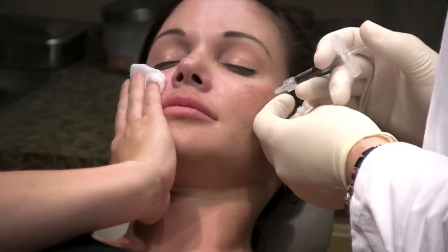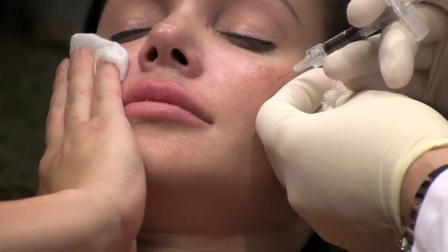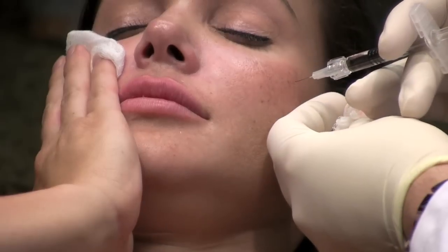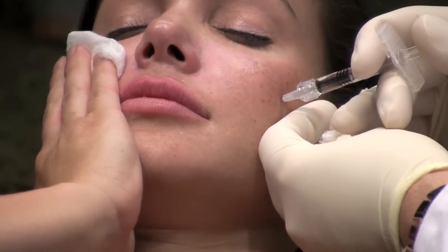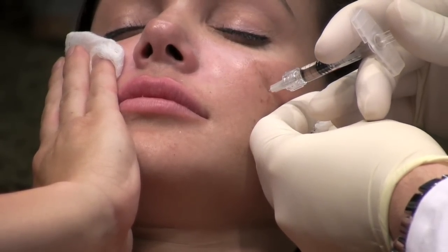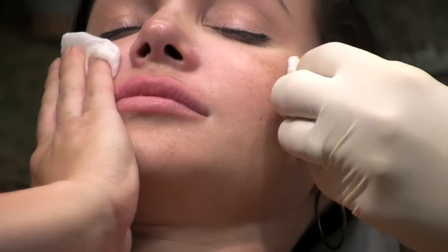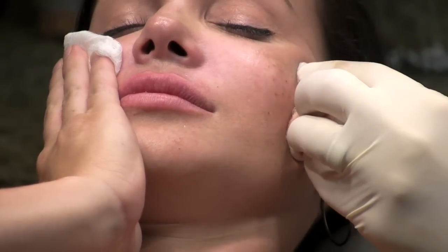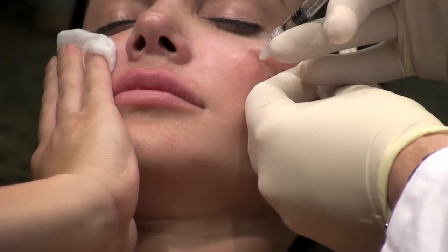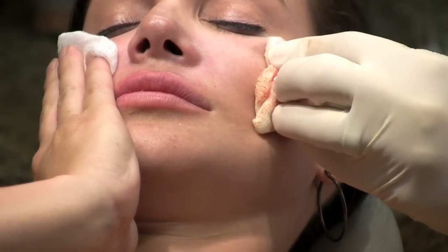So we're going to do the same thing. Again, for your first few, you definitely want to mark the patient in an upright position so you know exactly where you're going. So we end up as symmetric as possible. This is not an injection you want to do into the skin or subcutaneous. This is right on top of the bone, just like an implant. This is also not an injection that you're going to do in a serial parallel fashion. This has to be done straight down. So you're going perpendicular to the skin and bone. And you fill as you go.